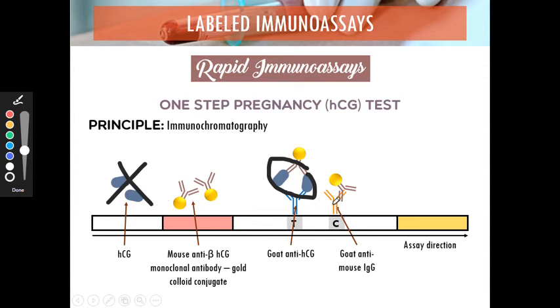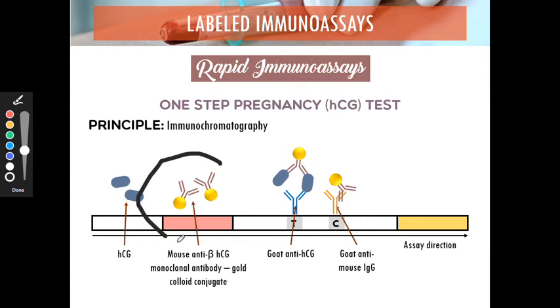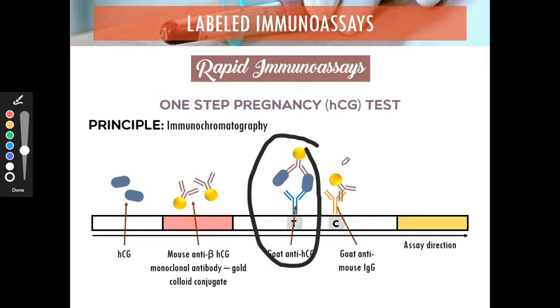Okay? Di ba? Always in a test kit there should be a control band appearance, because you cannot interpret a result using a test kit if there is no control band. That would mean your result is invalid. It means that your reagents are not working properly. Because why would this show a result but this one none?